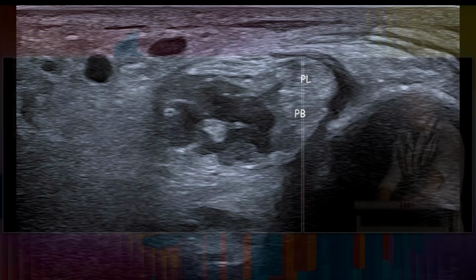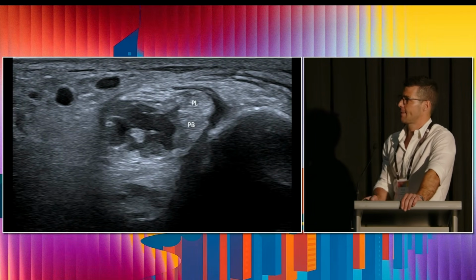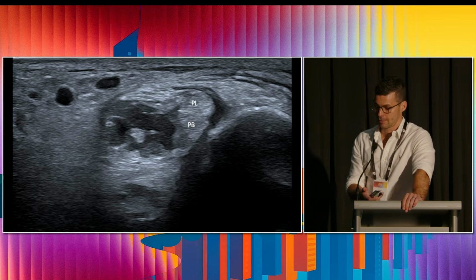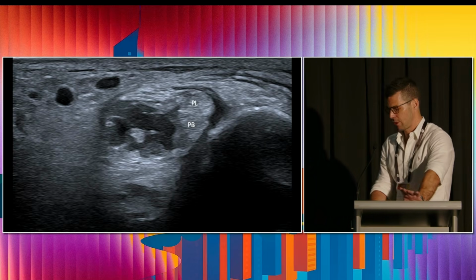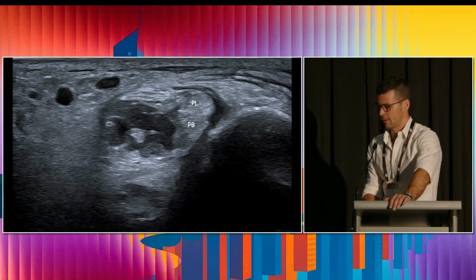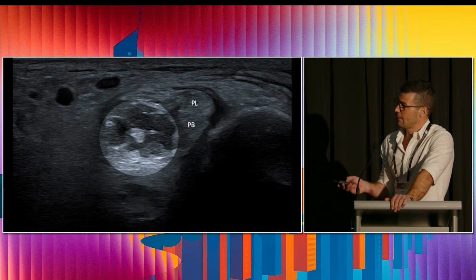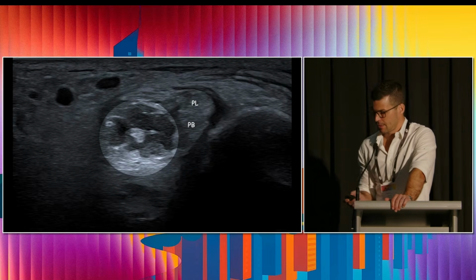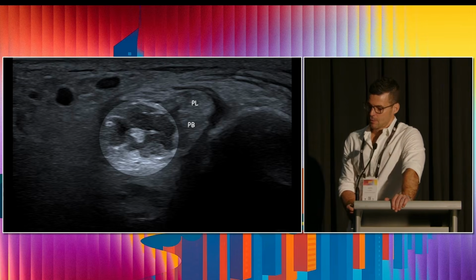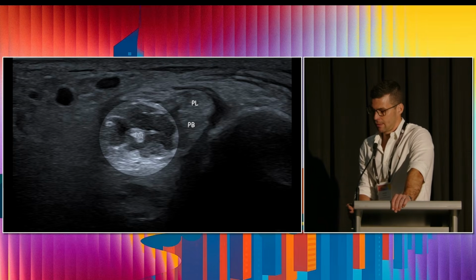Now, laterally, we are frequently asked to interrogate the peroneals for cases of tears, split tears, tenosynovitis, instability, subluxation, and pain. But we perhaps don't always attribute those symptoms and conditions to the presence of an accessory muscle or tendon. Here we can see peroneus longus and brevis, and here we've got a little accessory tendon. This is the peroneus quartus, a muscle that is infrequently or inconsistently described, named and classified in the literature.